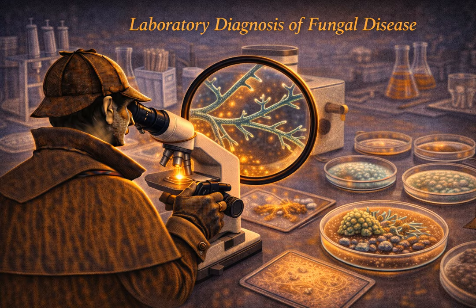Okay, so we have our specimen. We've collected it safely. We haven't ground it to dust. Now we need answers. We know culture takes time. We'll get to that. But the patient is sick right now. This brings us to section 2, direct microscopy. This is the speed run. Direct microscopy is really the only way you get a fungal diagnosis in under an hour. It allows you to start targeted treatment before the sun goes down.